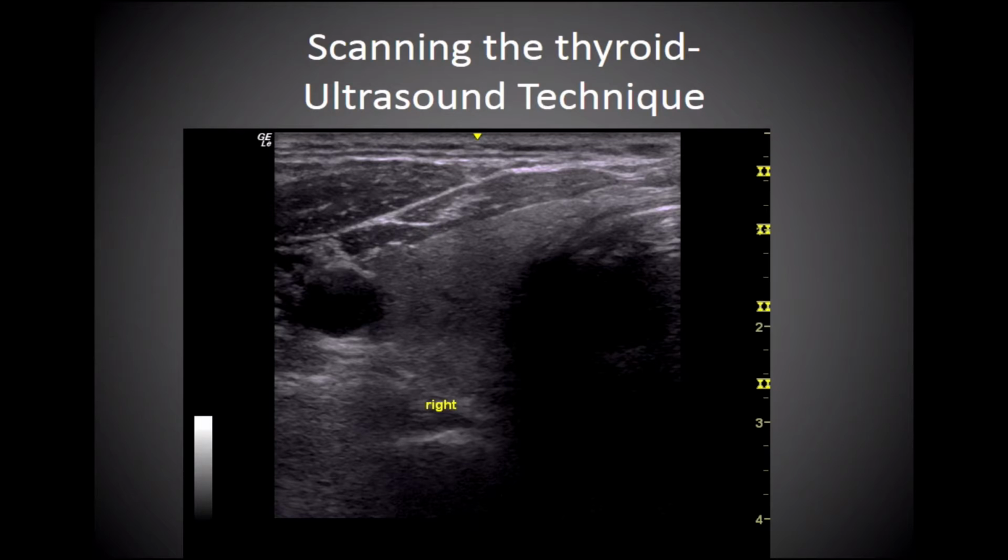The normal thyroid has circumferential vessels that go completely around the gland with feeder vessels entering and exiting the gland. The echo texture of the thyroid should be similar to liver texture and almost identical to testicular texture in the male and normal pancreas. It has a soft grayscale appearance and is usually moderately vascular. Neck muscles are striated and encapsulated and less echogenic than adjacent thyroid tissue.